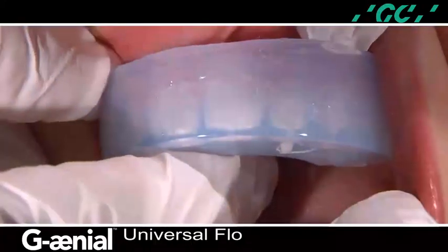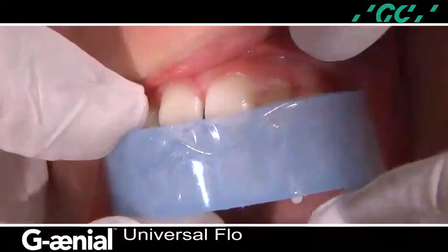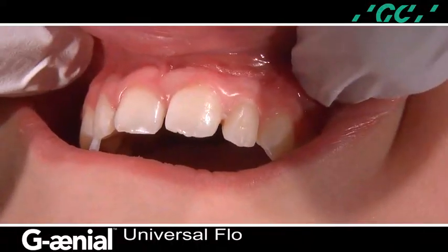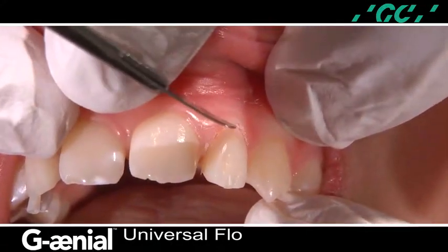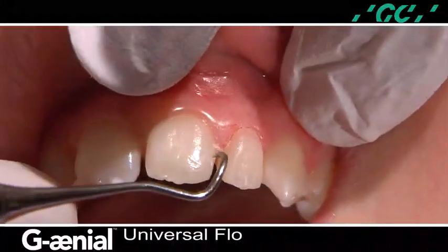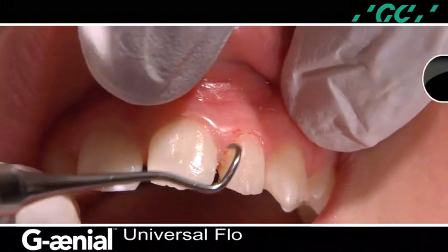The silicone matrix is gently removed, and notice the composite sprue is removed with the tray. And the excess polymerized composite resin is removed with a scalpel blade, a number 12 BD Bard-Parker, and an interproximal scaler, an S204S by Hu-Friedy.